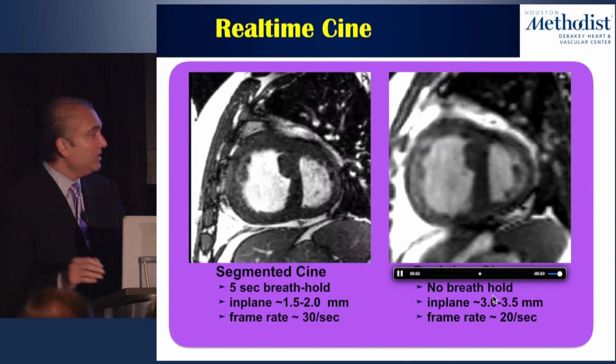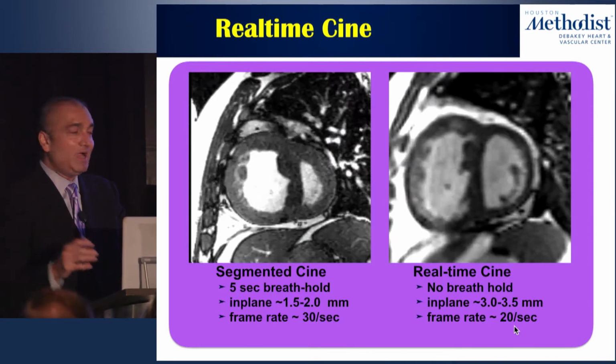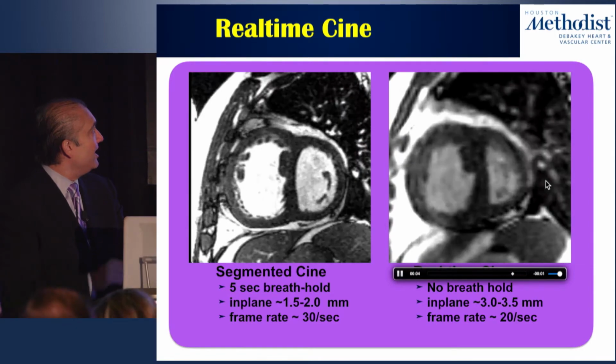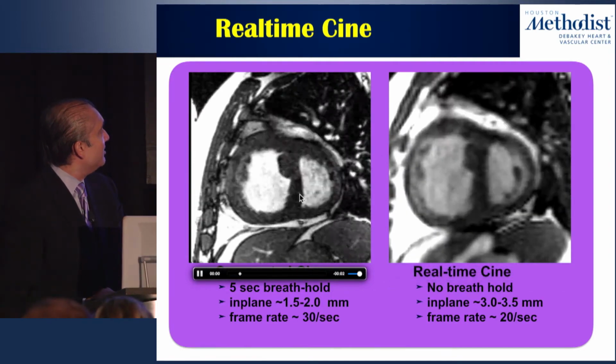This requires no breath holding, but the in-plane resolution is about 3 to 3.5 millimeters, and the frame rate is about 20 frames a second. So a little bit of a compromise. But again, I think if I showed you this image to start off with and said, hey, this is a nice image, most of you would agree and say, yeah, it's not bad. So obviously, we get spoiled by being able to acquire images like this.